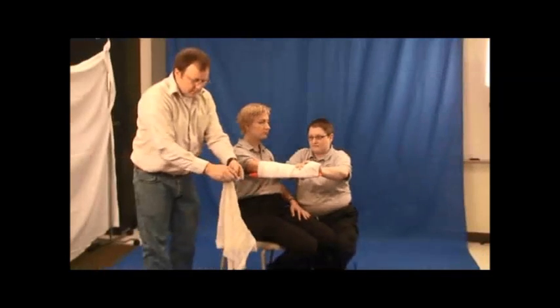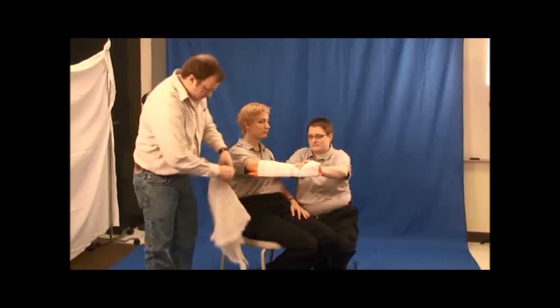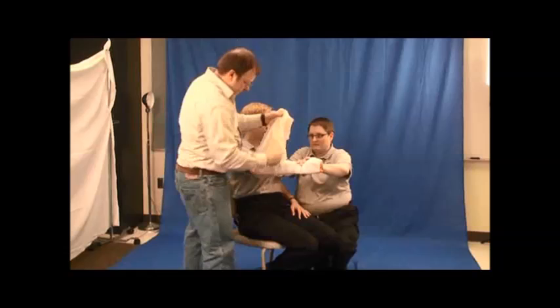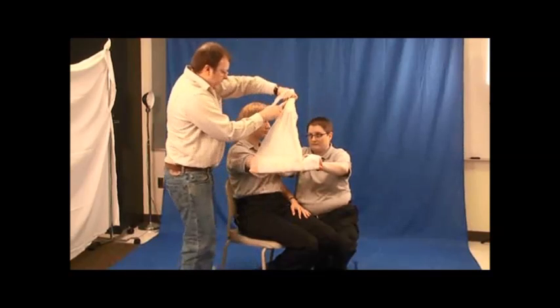Create a sling and bring it towards the body.